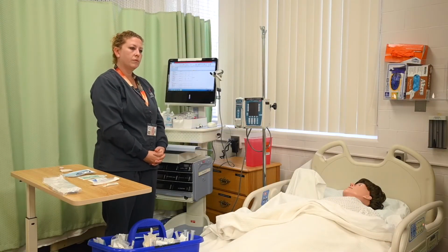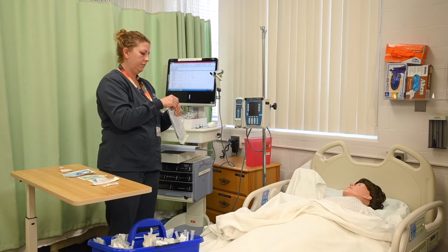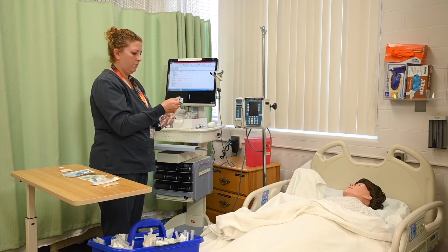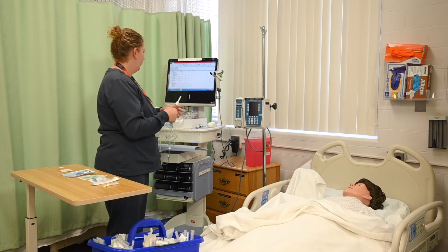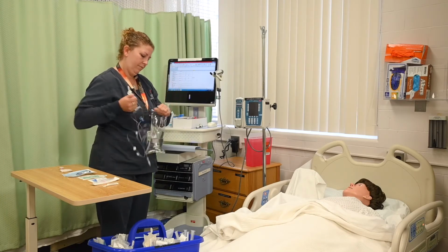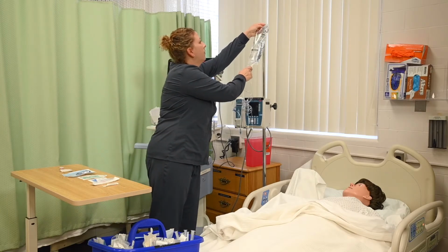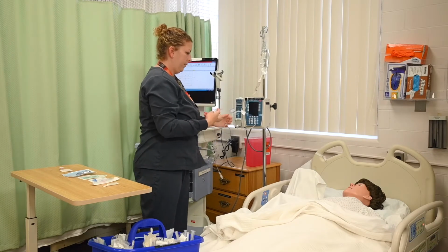Okay, now she's going to prepare the bag, and she would say, I would spike the bag and prime the tubing and place the tubing in the IV infusion pump. I have a Alaris IV infusion tubing. I'm going to close my roller clamp. And aseptically spike my bag. Squeeze the chamber and prime the tubing.